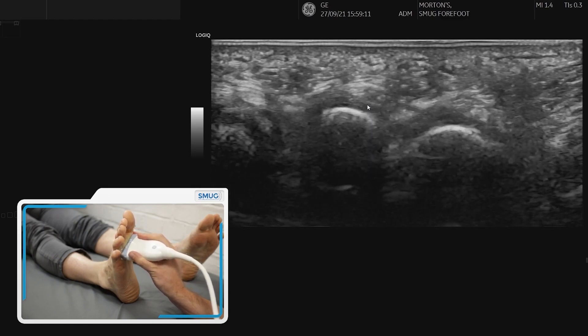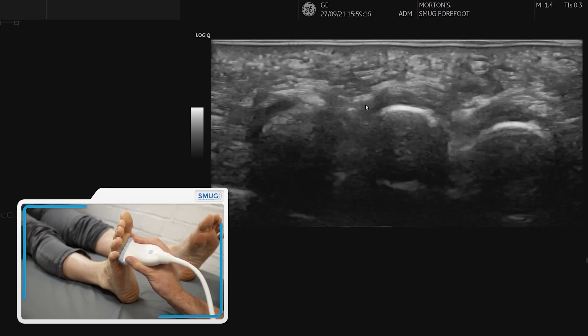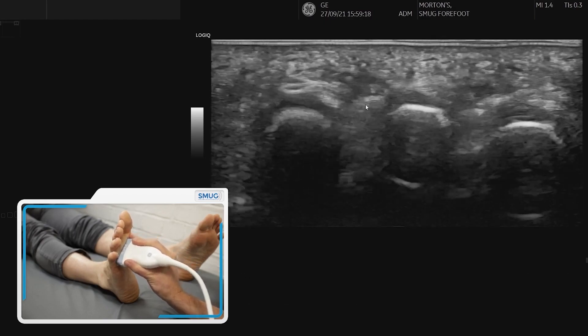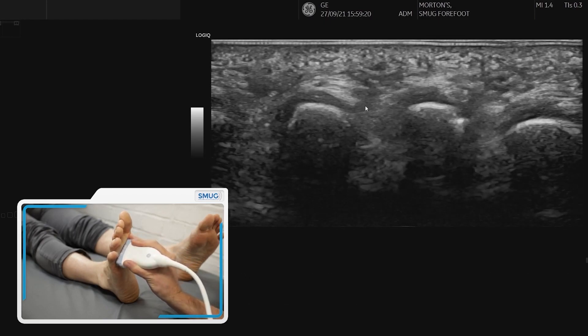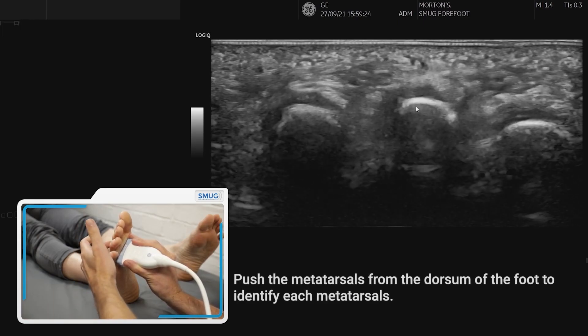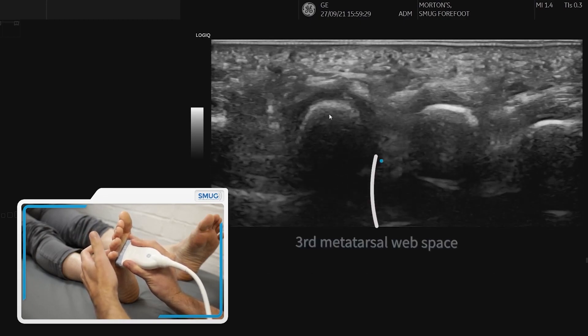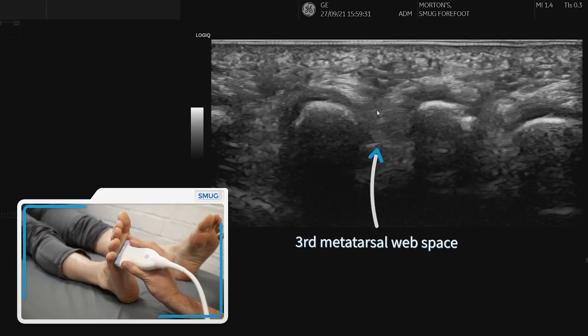Most Morton's neuromas are between the third and the fourth toe in the third web space, so we need to first be sure that we're on the right web space. We just push from the top — you can see this is the third and this is the fourth, so that space in between is where we need to look.